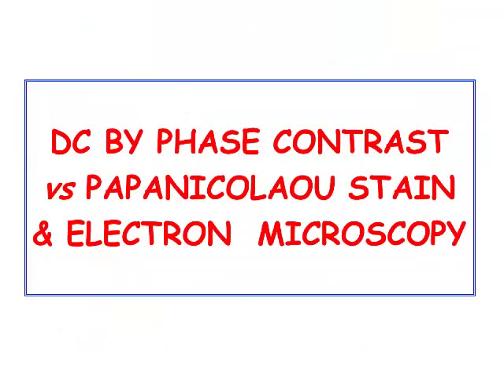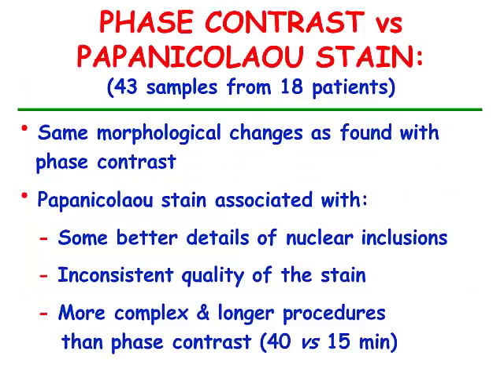And to be sure, at a certain point, after having developed our experience, we decided to compare our findings with the findings obtained by Papanicolaou stain.